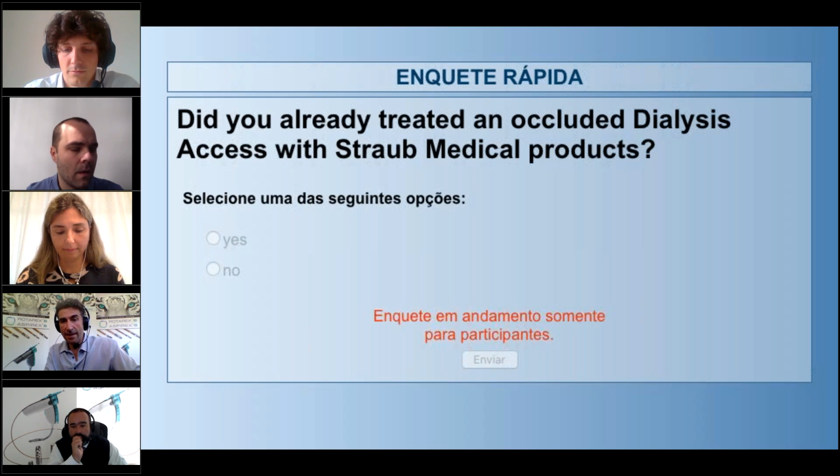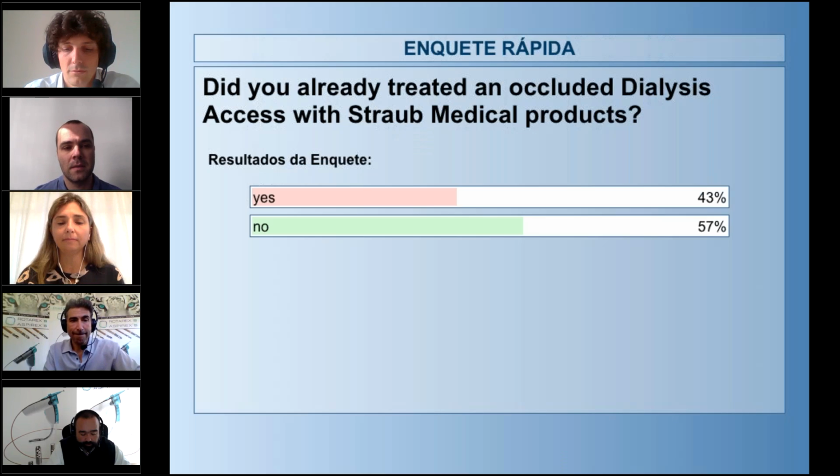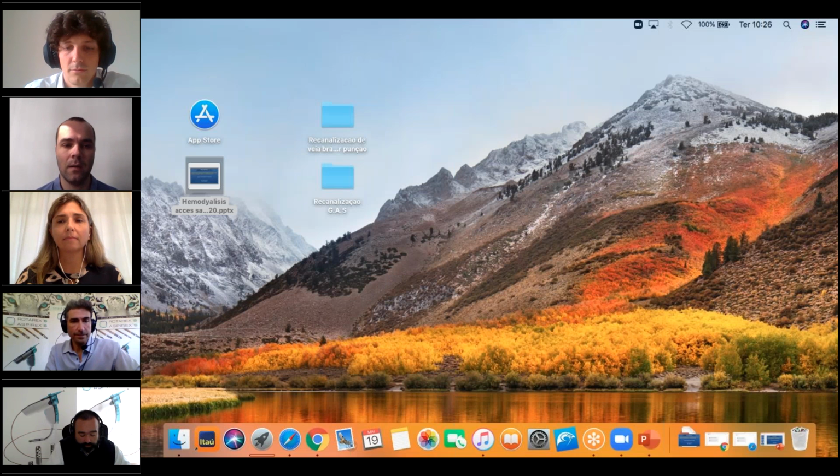I think embolization is a reality, but I have never had a problem with that. I think with almost all procedures that you do, you have some embolization. What I'm concerned about is to not treat the stenosis before the thrombus aspiration. So do the thrombus aspiration as well as you can, and after that you treat the stenosis, so the embolization is not going to be too large.